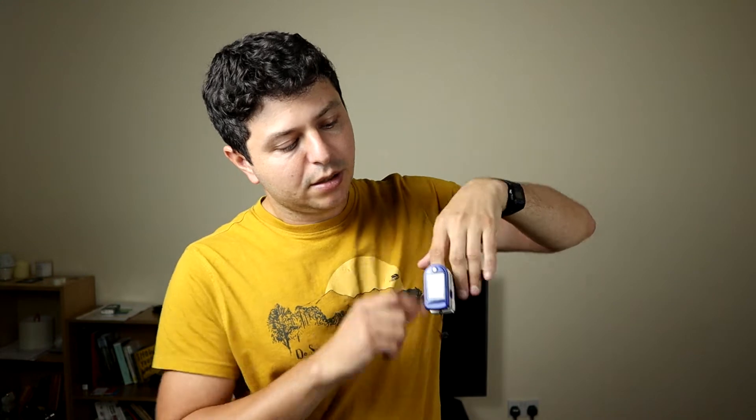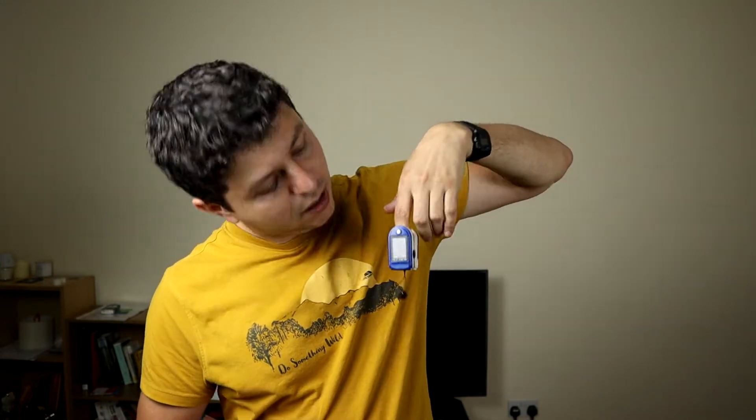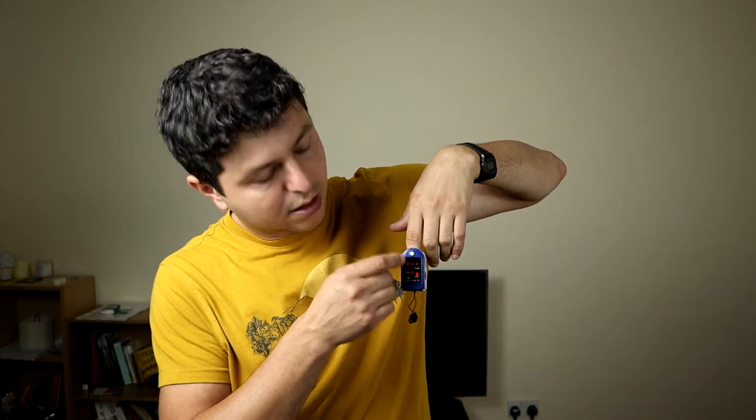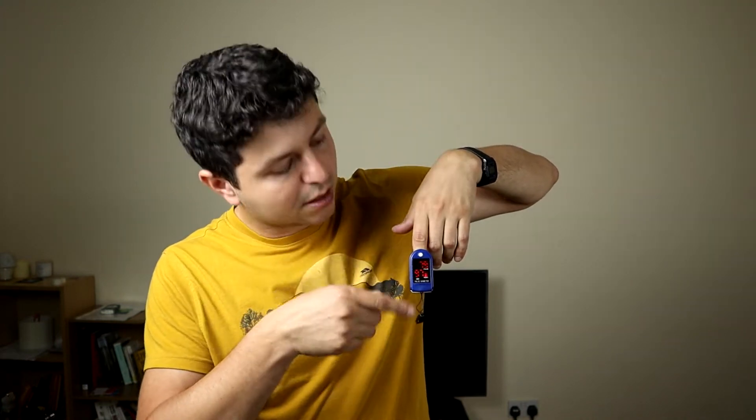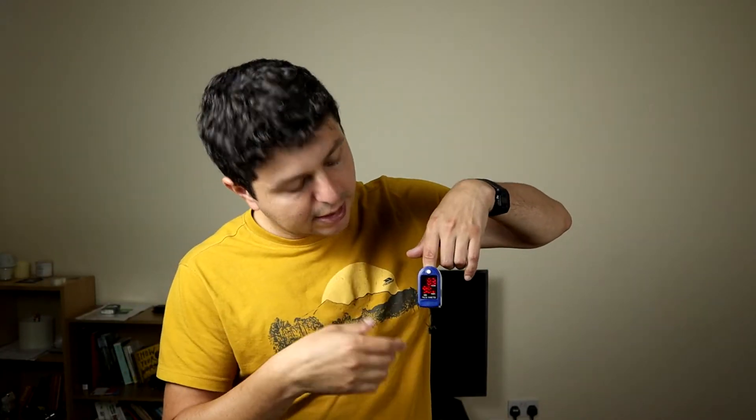When you press the button and leave it carefully, it will start reading. Most of them have either bars that go up and down or they show you an actual pulse wave. When you see that wave is regular — either the bars going up and down in a regular fashion, or the pulse wave being fairly regular — you know that you're basically getting a good reading.